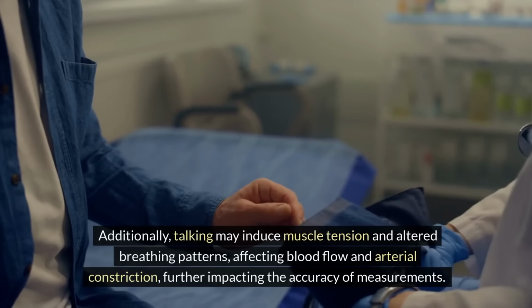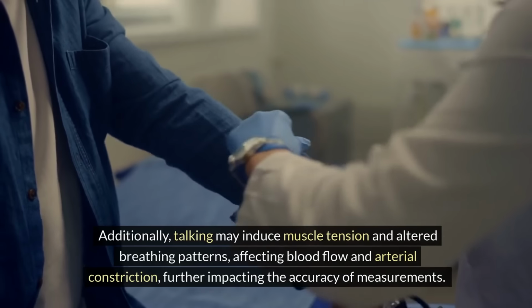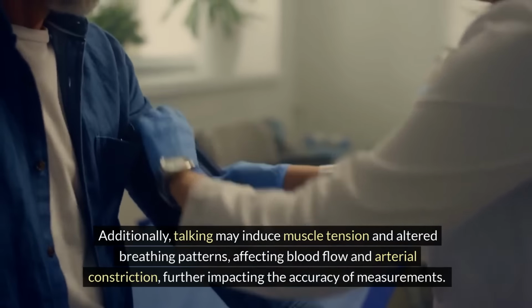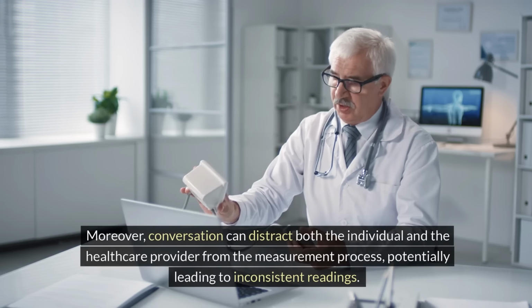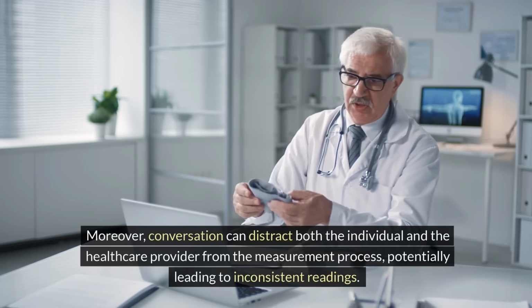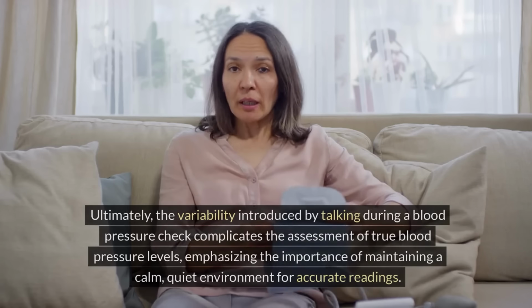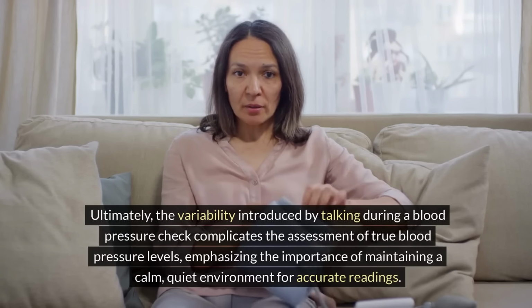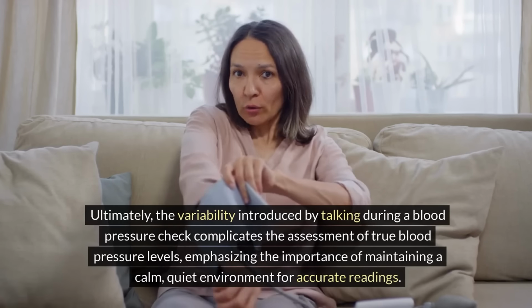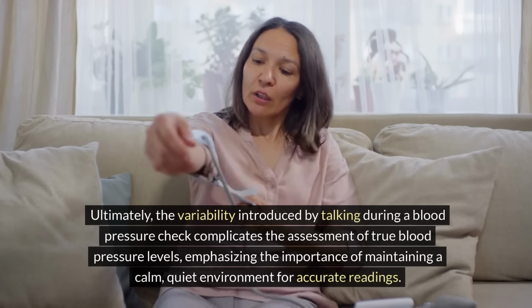Additionally, talking may induce muscle tension and altered breathing patterns affecting blood flow and arterial constriction, further impacting the accuracy of measurements. Moreover, conversation can distract both the individual and the healthcare provider from the measurement process, potentially leading to inconsistent readings. Ultimately, the variability introduced by talking during a blood pressure check complicates the assessment of true blood pressure levels, emphasizing the importance of maintaining a calm, quiet environment for accurate readings.